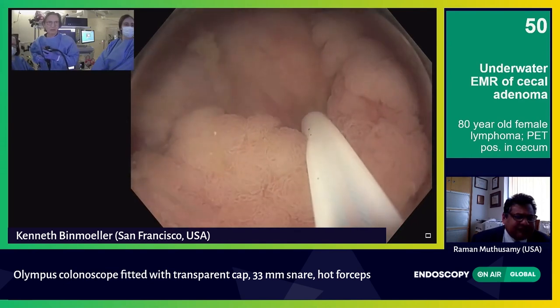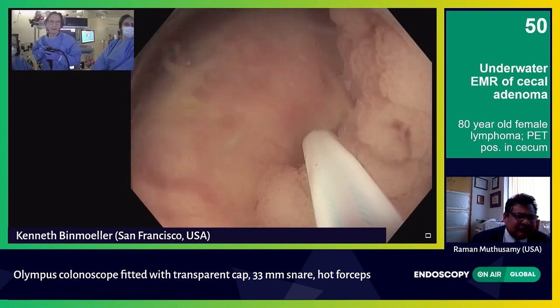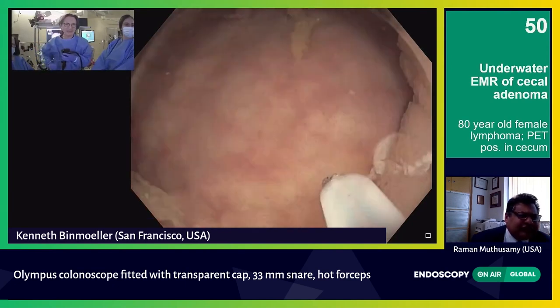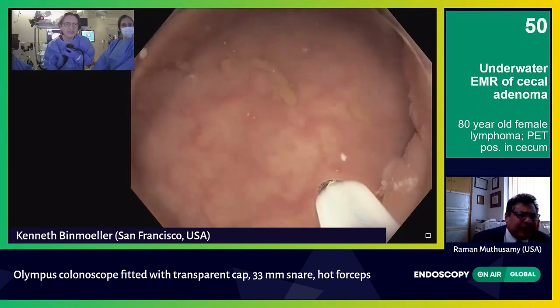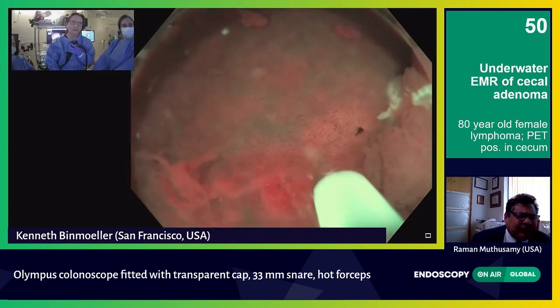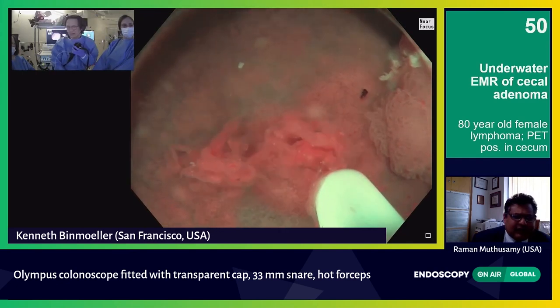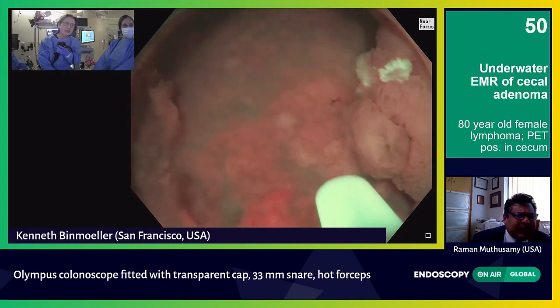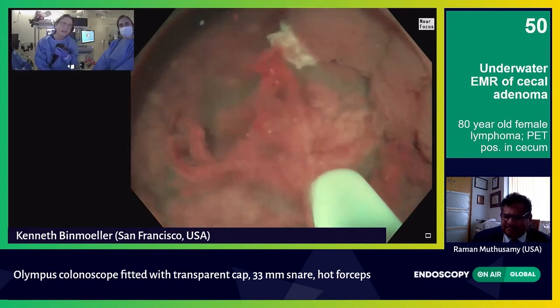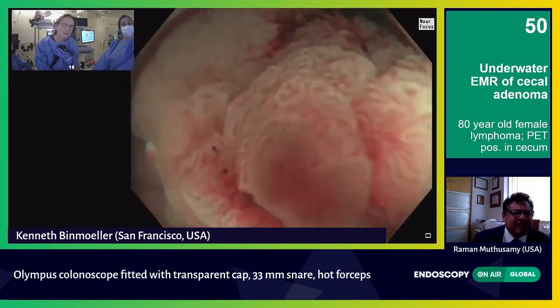Where the mucosa is normal — here it's normal. That's how we can make those dots. You can see that so precisely. Pull the snare back a little bit so you want it always flush — you don't want to create holes here. Jeannie, can you give a little water as I'm doing this? The resolution is just so exquisite here underwater, and I can really go right next to the lesion, right at the margin.